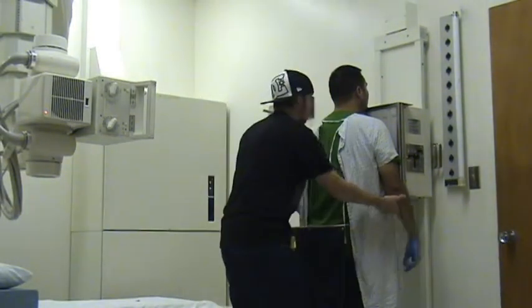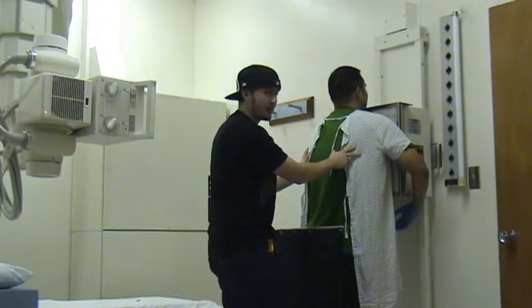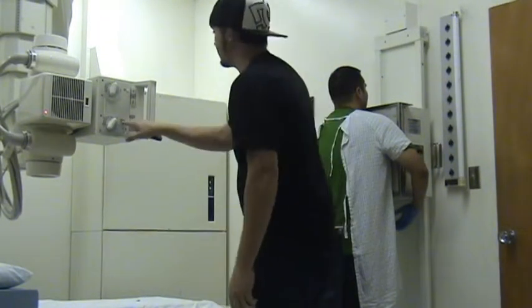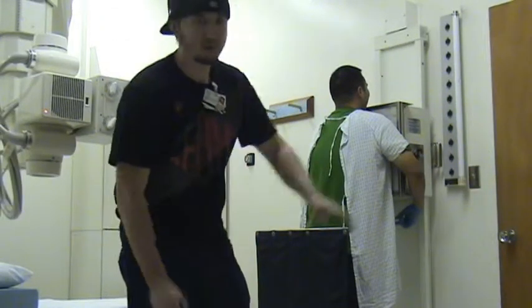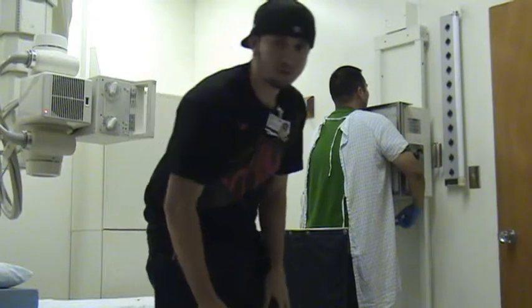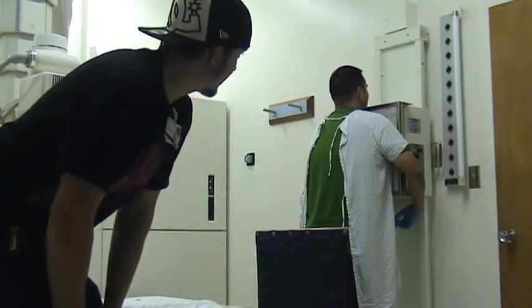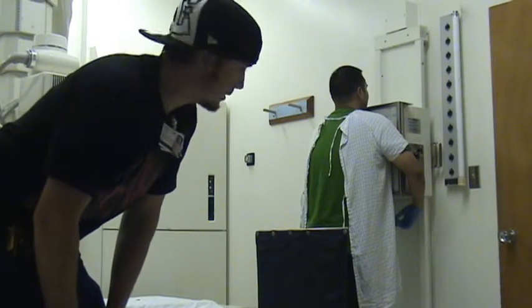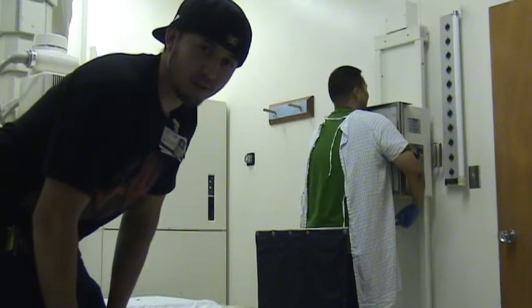Make sure that the arms are up or around, shoulders forward, to get the scapulas out of the way. So we're going to go to the console right now and set the technique. I'll go like 120 at 8. It's a little bit bigger density, so we have to shoot through a lot more.